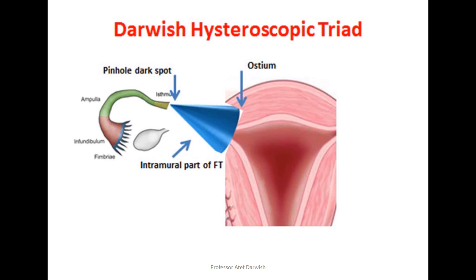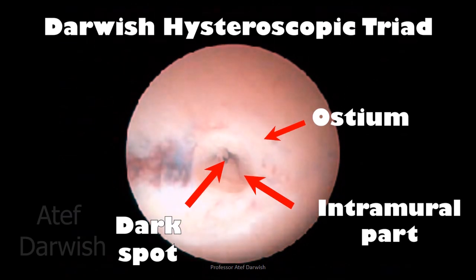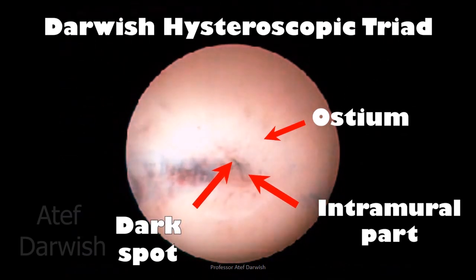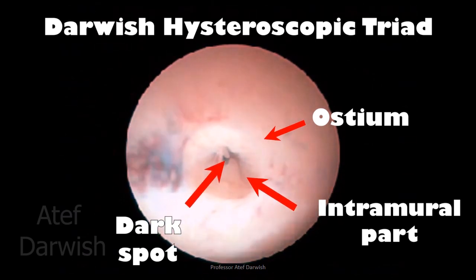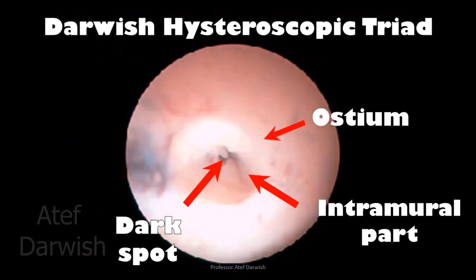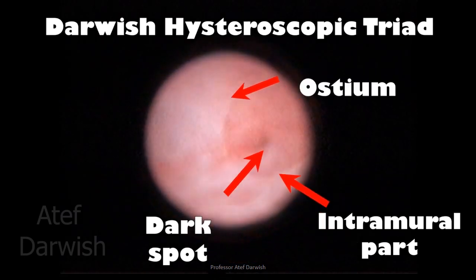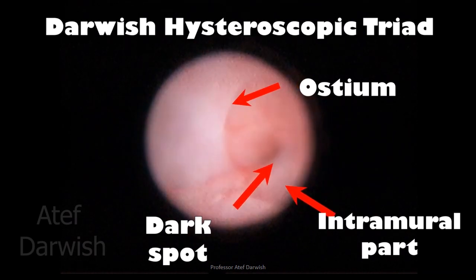The Darwish hysteroscopic triad is a conical part of the fallopian tube whose base is the tubal ostia and whose apex is a pinhole dark spot representing the narrowest part of the fallopian tube. The lateral walls of this cone are formed by the intramural part of the fallopian tube. In this video you can see the ostia as a fine circle; inside it you can see the cone with converging walls formed by the intramural part, and the summit is a dark spot representing the narrowest part of the fallopian tube.